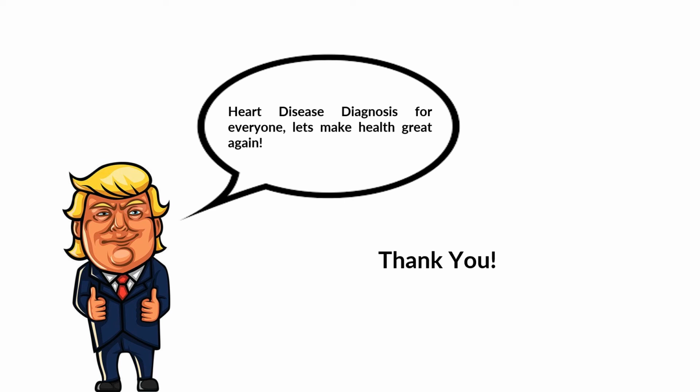There are still improvements to be made on the device for better performance in the journey of dethroning cardiovascular disease as the number one cause of death in the world.